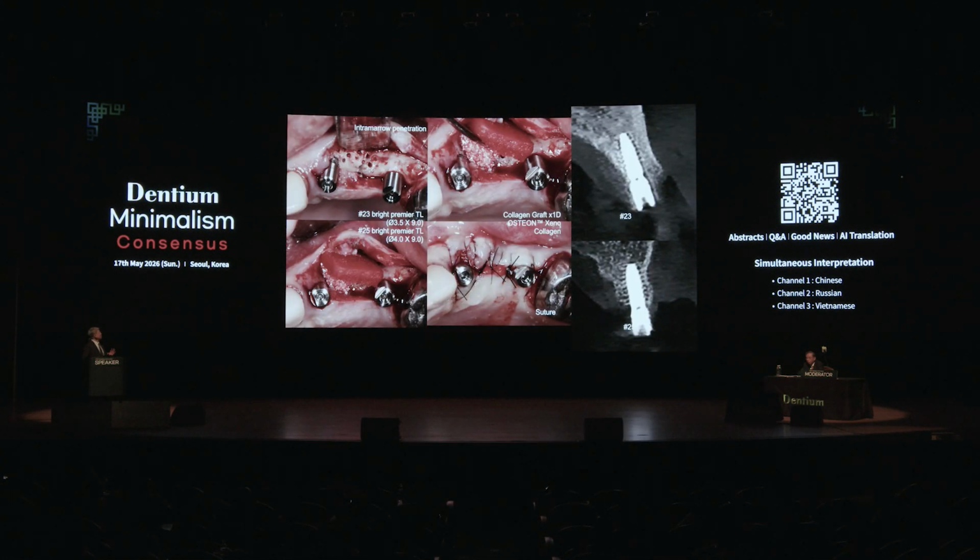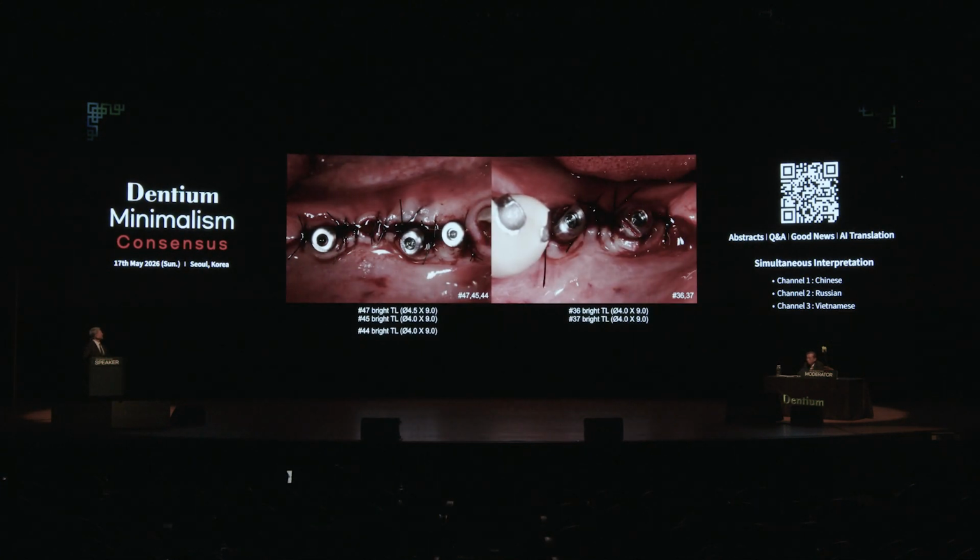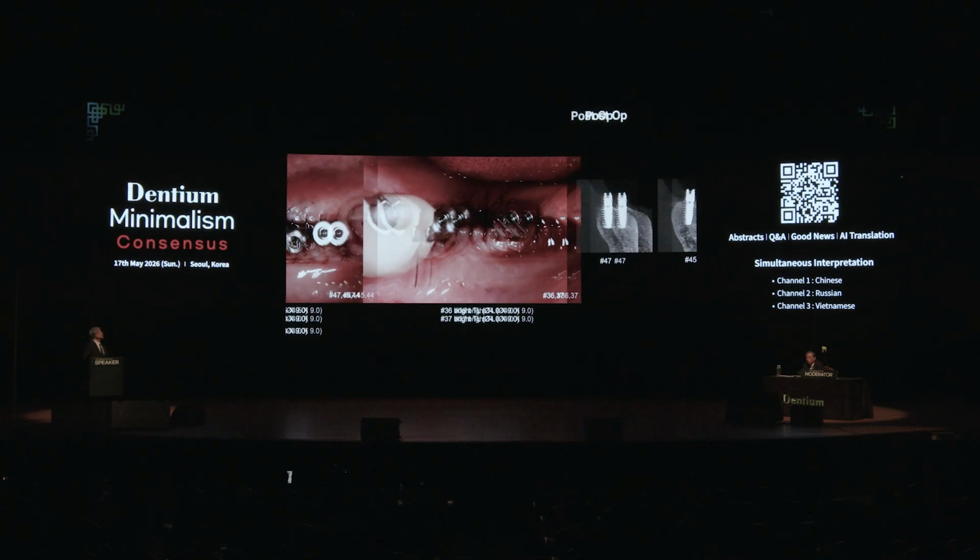And so we did the surgery. In this area the bone was relatively thin, together with the pontic area, so we did a very simple bone graft with collagen. We finished the sutures. The lower side is the same.